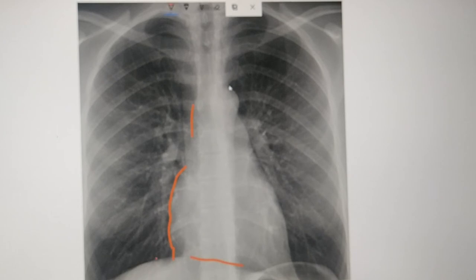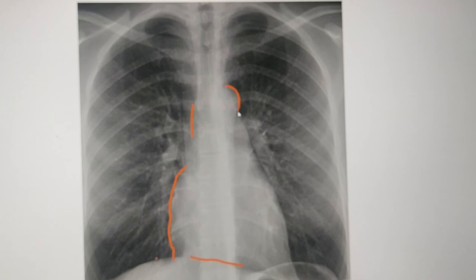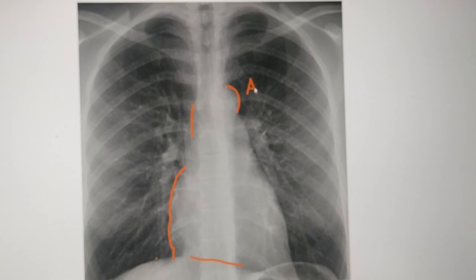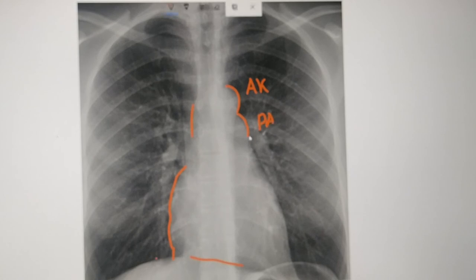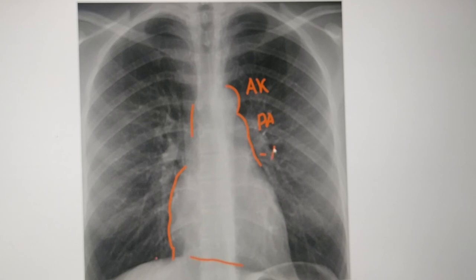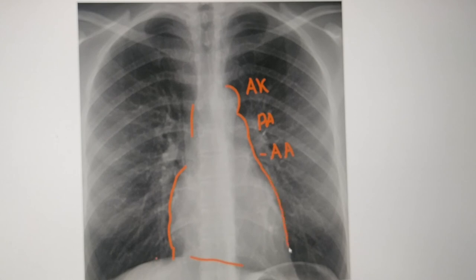Now for the left border of the heart: the first bump or swelling is formed by the aortic knuckle. The second bump or swelling is formed by the pulmonary artery. The next part is formed by the left atrial appendage. And the next portion is formed solely by the left ventricle.